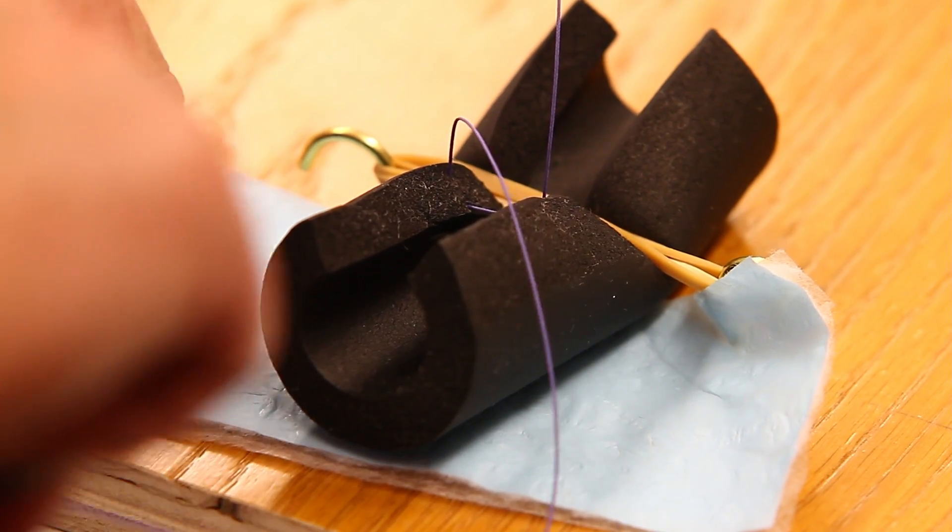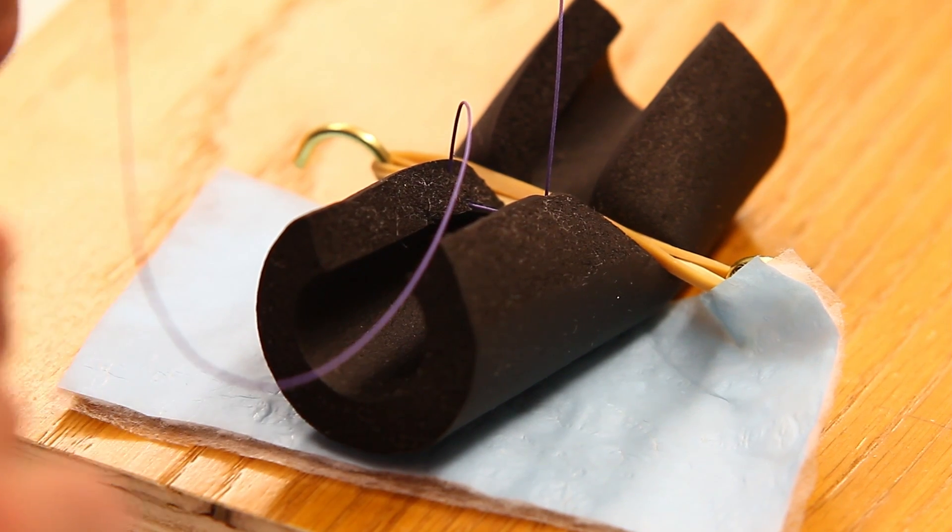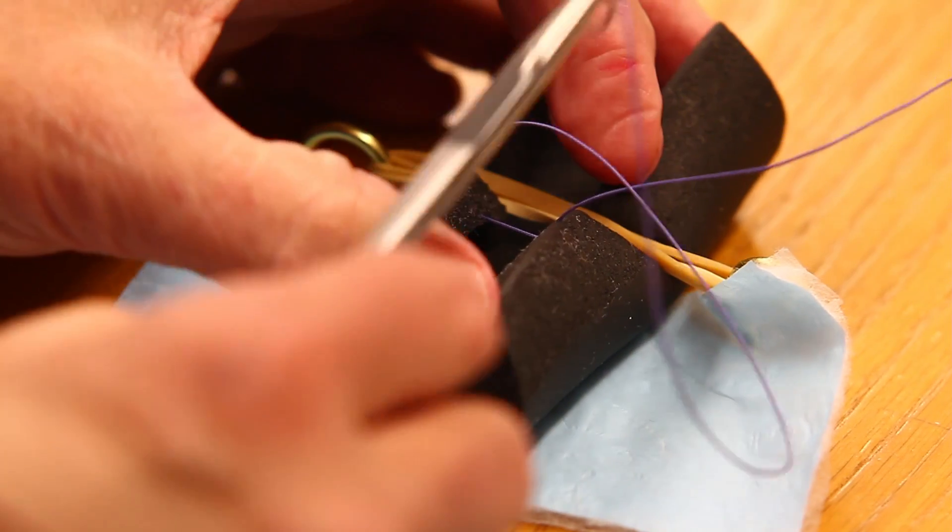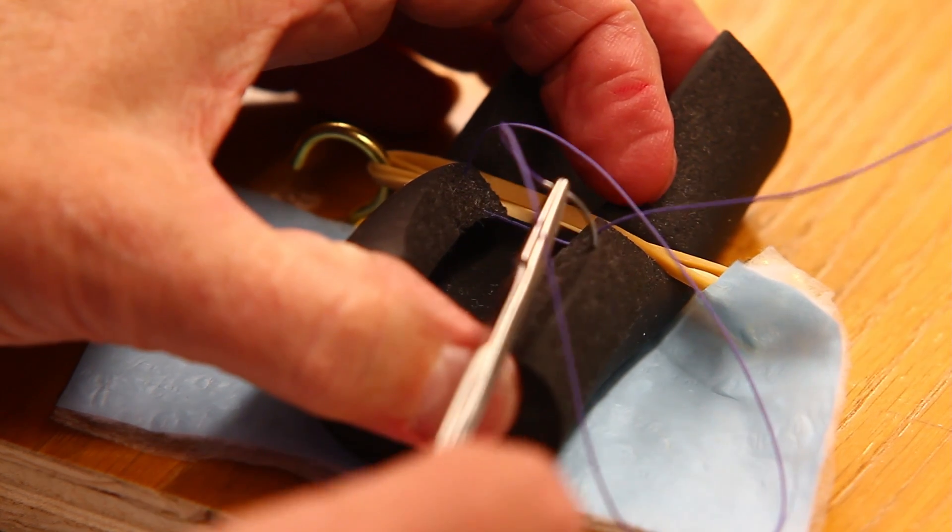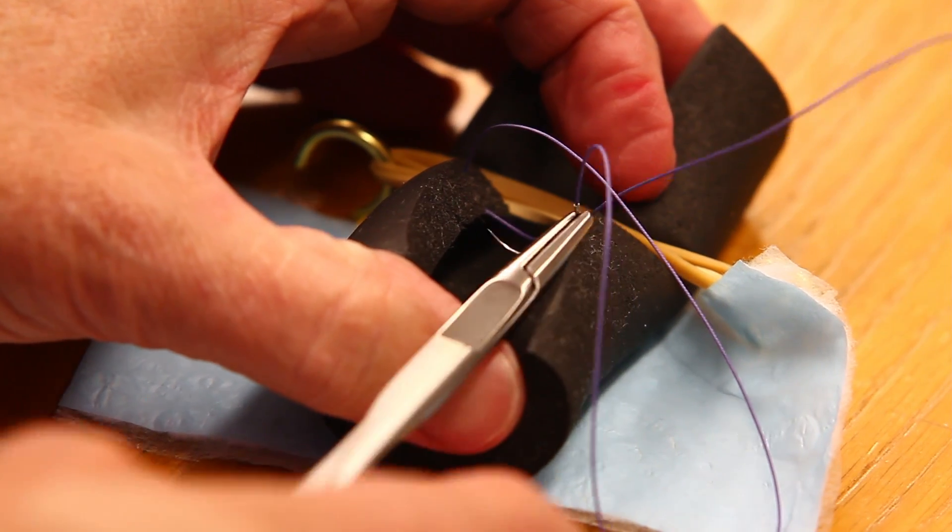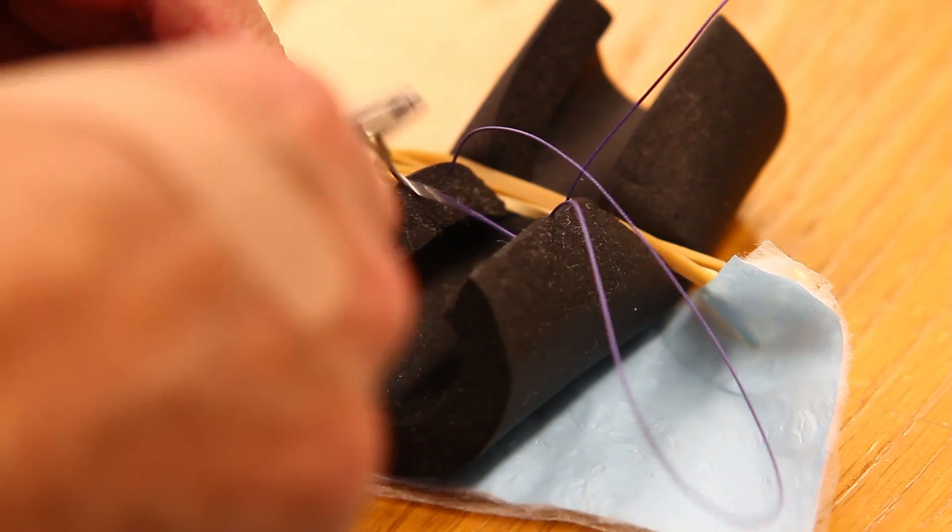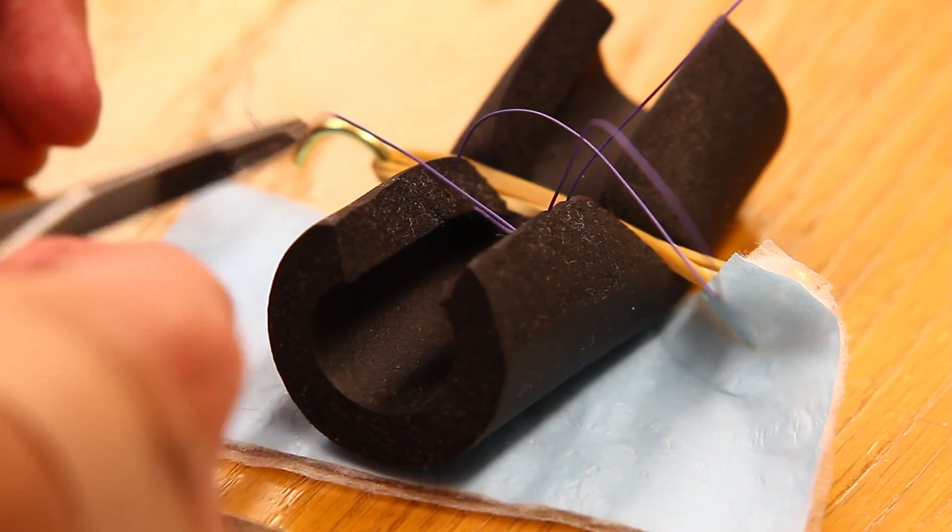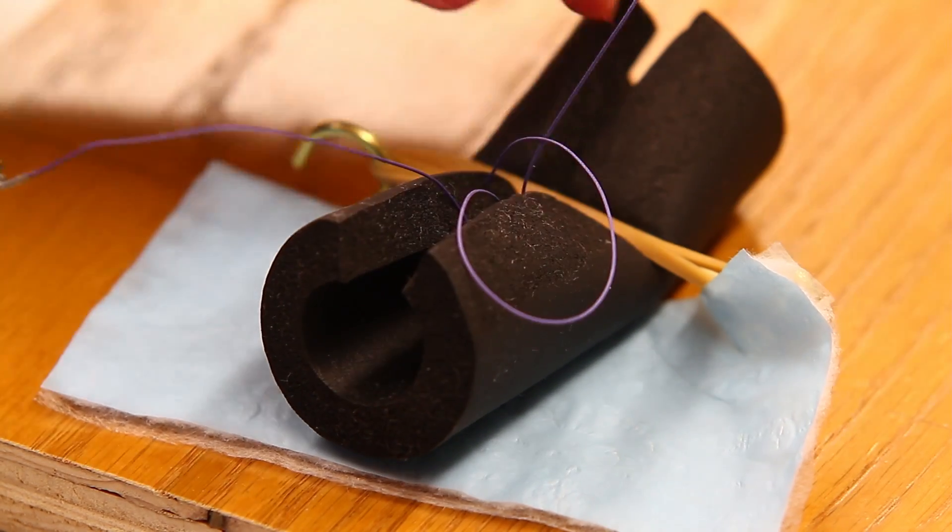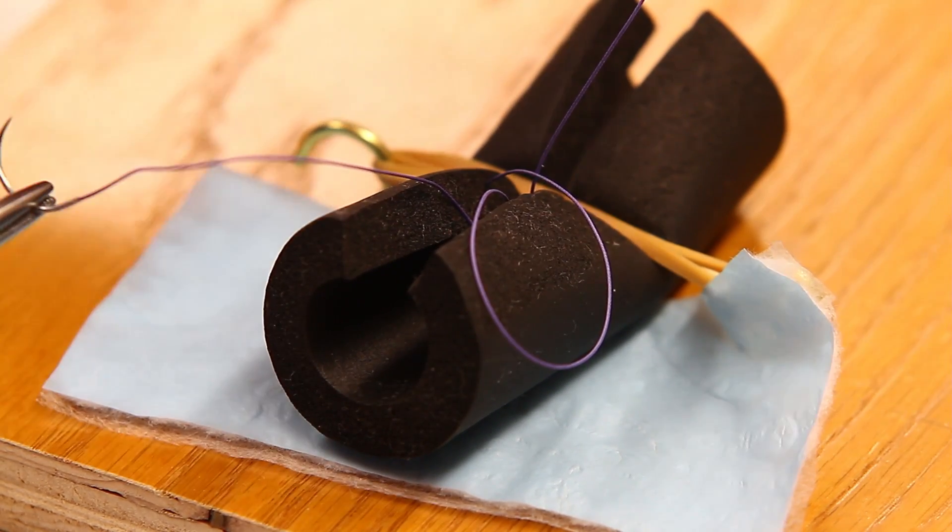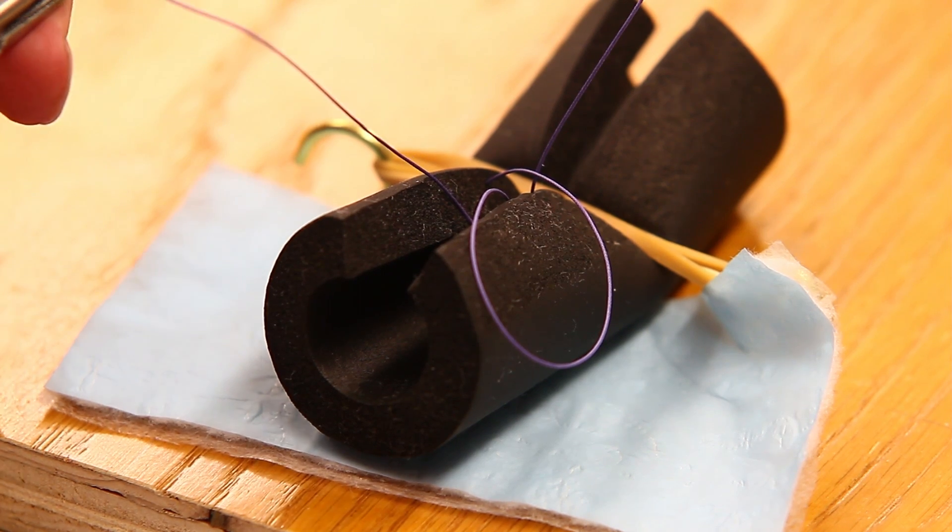The smaller needle allows this smoother work. The CT1 needle is a little too big. These sutures should be about a centimeter apart as we move outward. And you start at the end of the rectal laceration and put a stitch at the end of it or right beyond the end of it.